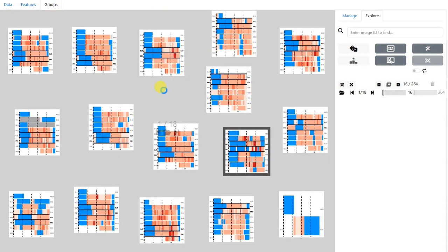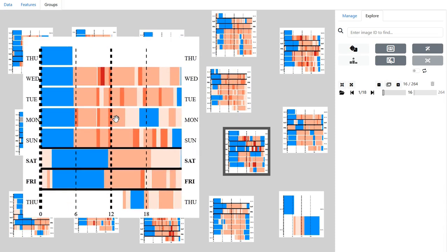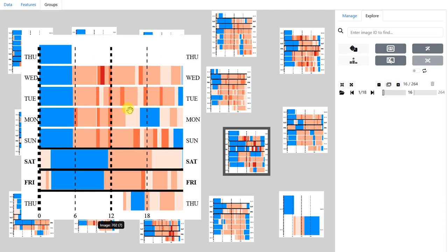It's very fluid. The idea here: this image represents a patient measurement based on wearable data. For one patient, who wore a wearable device for a week, you see in blue the sleep time, the x-axis is the time, the days are each row, and the orange color is the activity level.